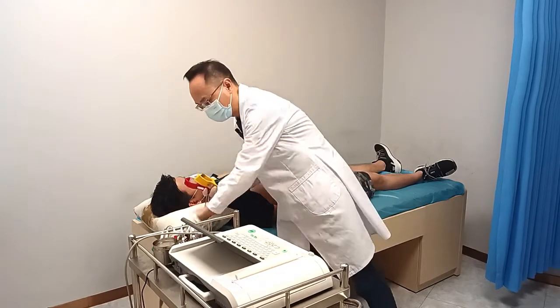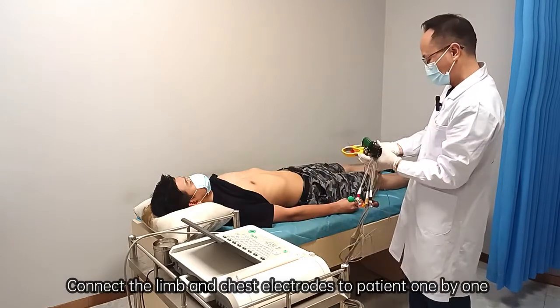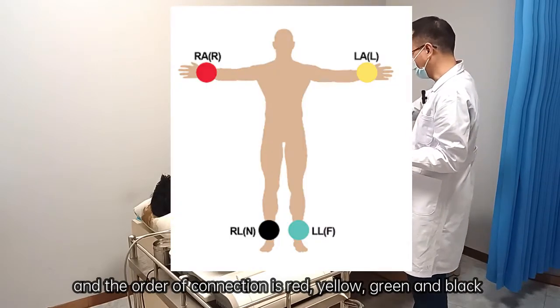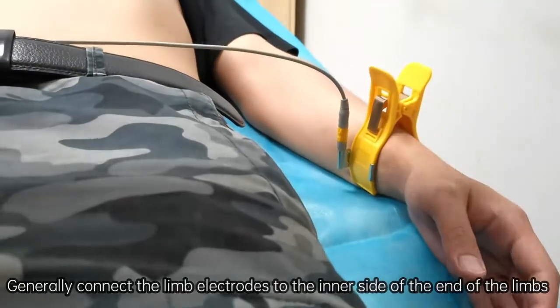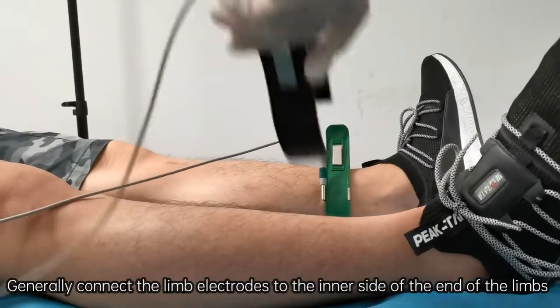Take the limb and chest electrodes and connect them to the patient one by one. Stand at the bottom right of the patient. The order of connection is red, yellow, green, and black. The metal surface of the electrodes should contact the areas where alcohol was applied. Generally connect the limb electrodes to the inner side of the end of the limbs.